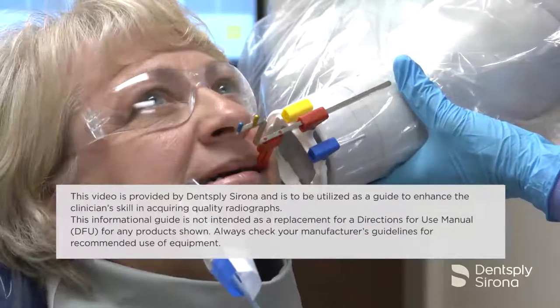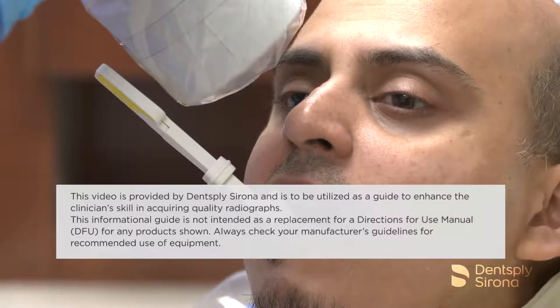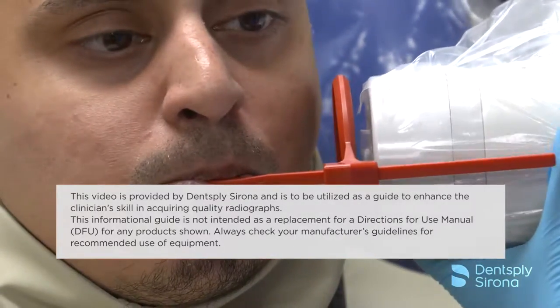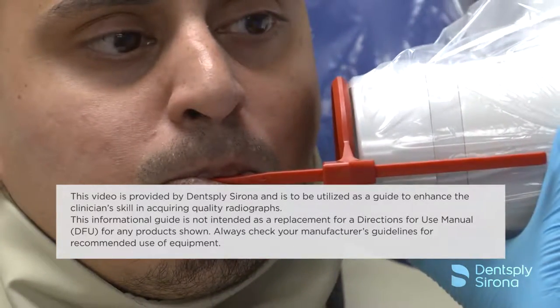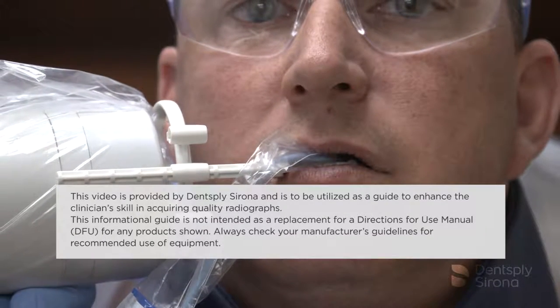This video is provided by Dentsply Sirona and is to be used as a guide to enhance the clinician's skill in acquiring quality radiographs. This informational guide is not intended as a replacement for the directions for use manual for any product shown. Always check your manufacturer's guidelines for recommended use of equipment.